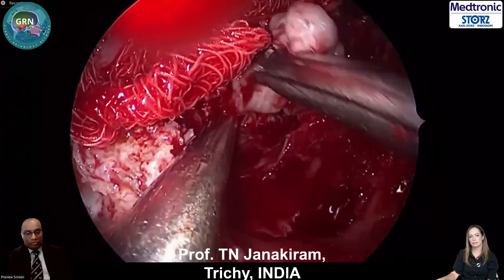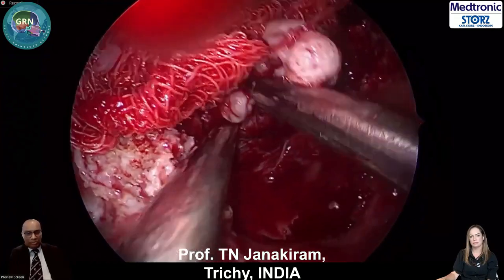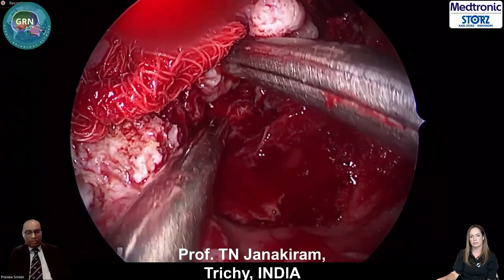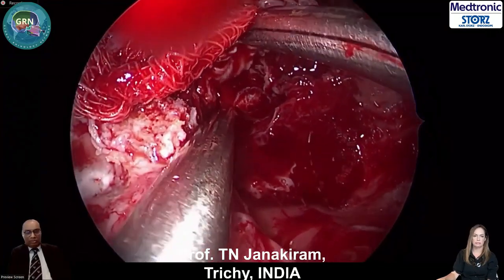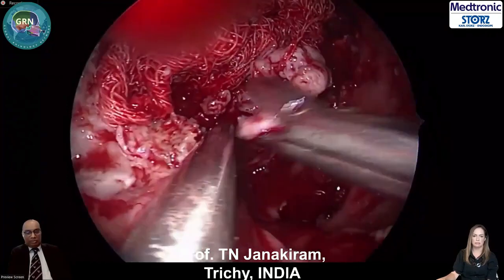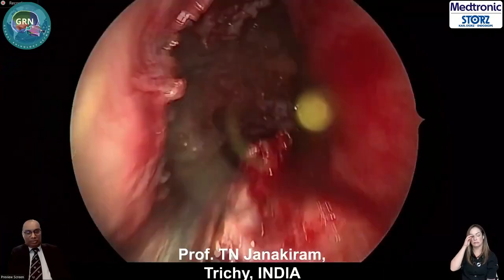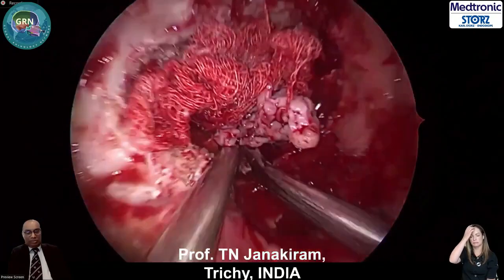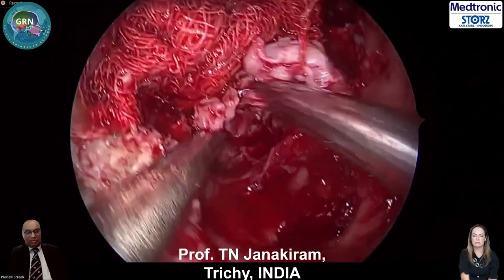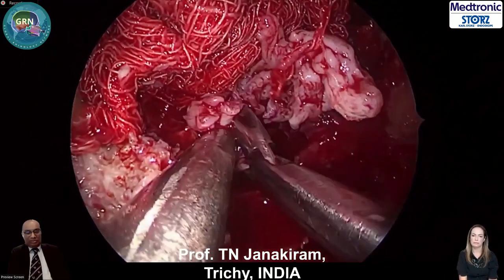This is called rolling up maneuver. There are two important maneuvers you should know in JNA surgery. One is rolling down and second is rolling up maneuver. So I'm just trying to roll up this tumor. I can also partially amputate it and go for segmental resection later.